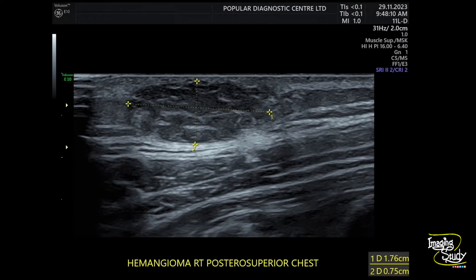We have measured the lesion — it's around 17 millimeters by 7.5 millimeters. There are several differentials for this lesion, so we want to apply color Doppler to differentiate among them.